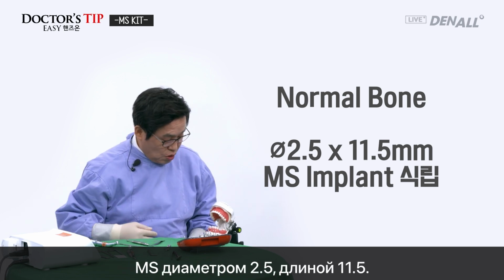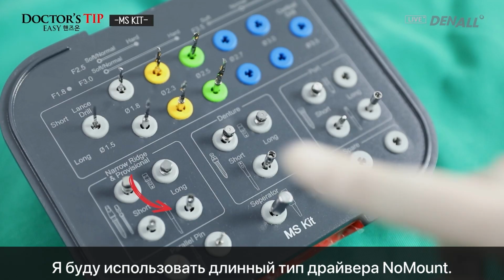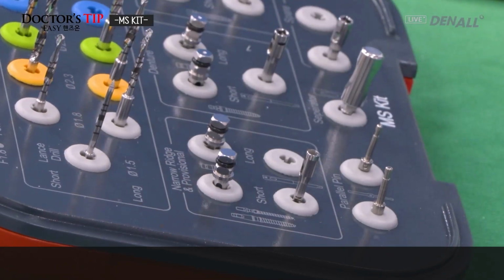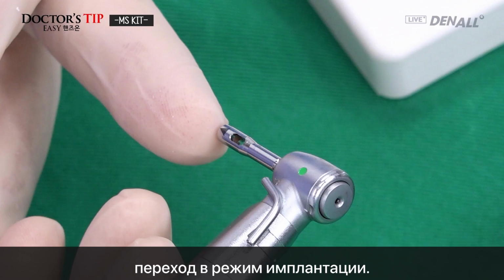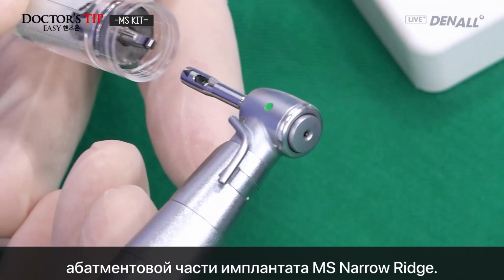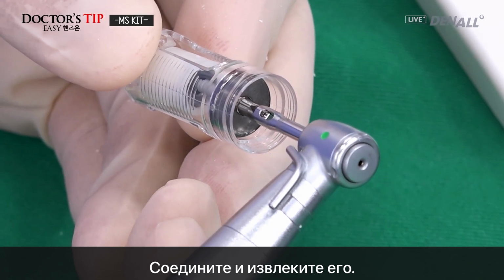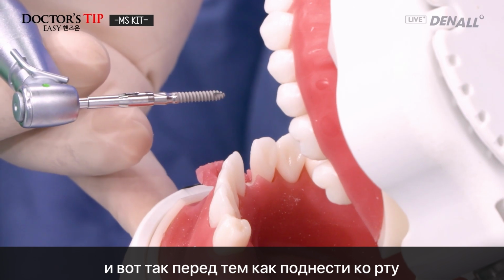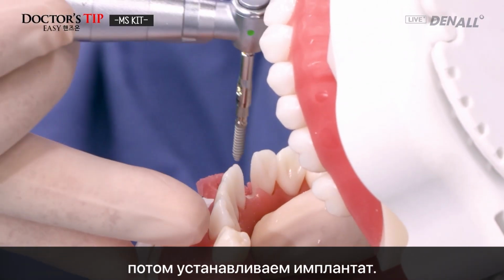So the 2.5, 11.5 MS implant will be placed. I will use the no-mount driver, the long type. And change to the placing mode, which is marked with the triangle, and that needs to connect to the MS fixture's flat part like this. Connect, and you pull it out, and like this. Before pushing it in the mouth, you check that it's in the correct mode, and then place the implant.